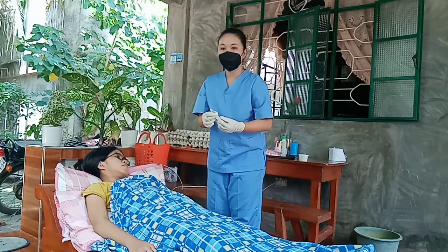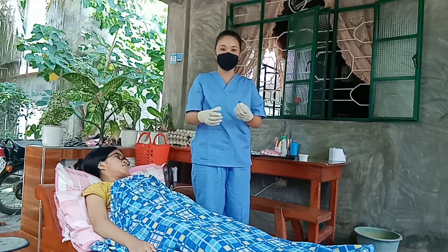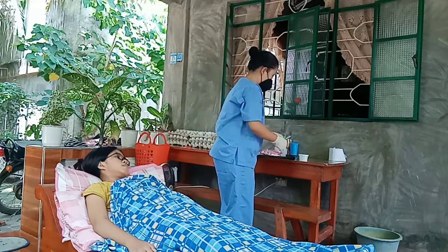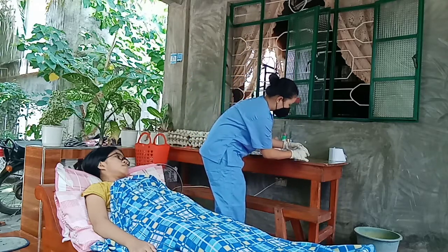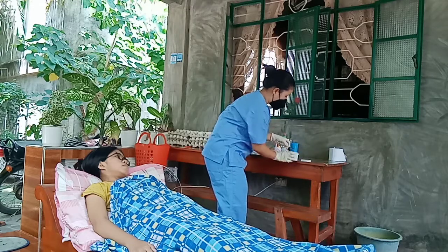Then, transfer urine from syringe to appropriate container. So, I will transfer the urine to the container. Open the container, then transfer the urine.